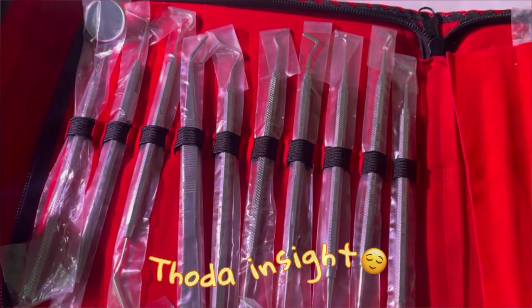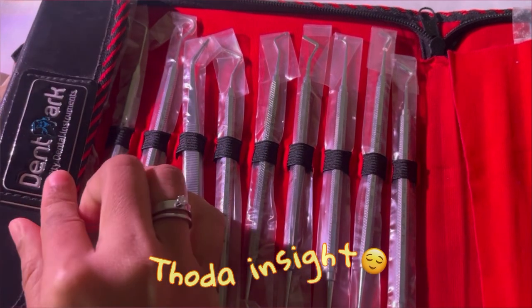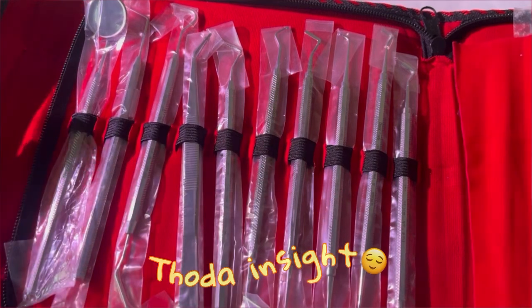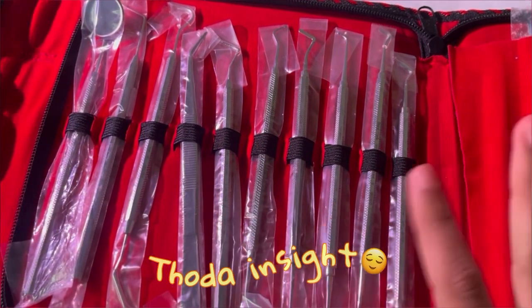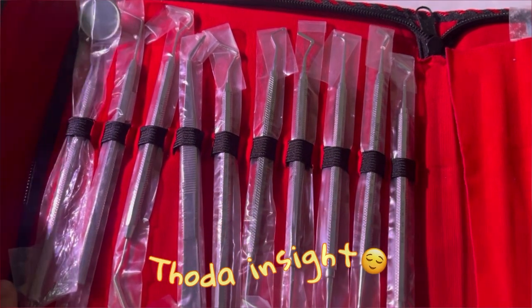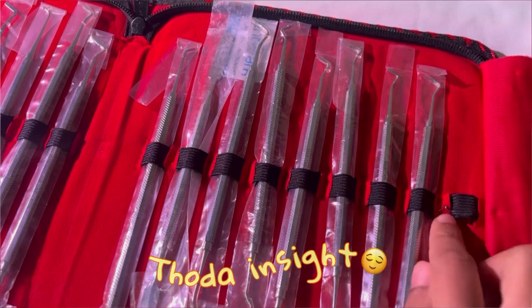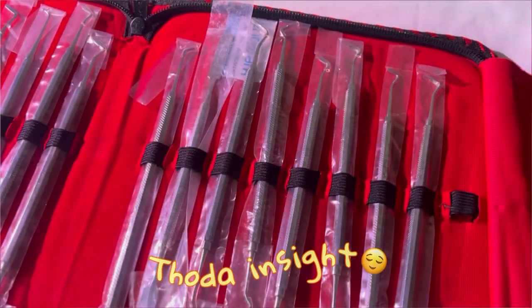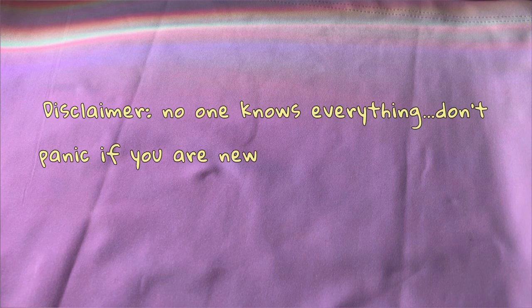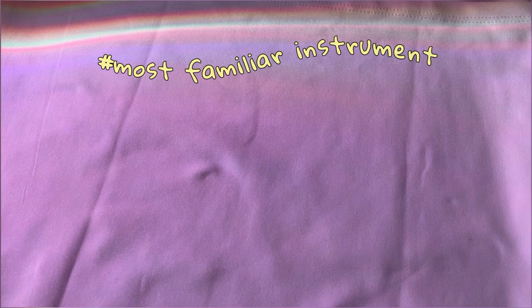First, let's get to know the GDC kit or any hand instrument kit. You don't need to buy GDC particularly — it's your choice — but other brands are cheaper than GDC and all the instruments are the same and they work perfectly well. These are the instruments you will find when you open a GDC kit. By the end of this video, you will at least know the basics of all the hand instruments.